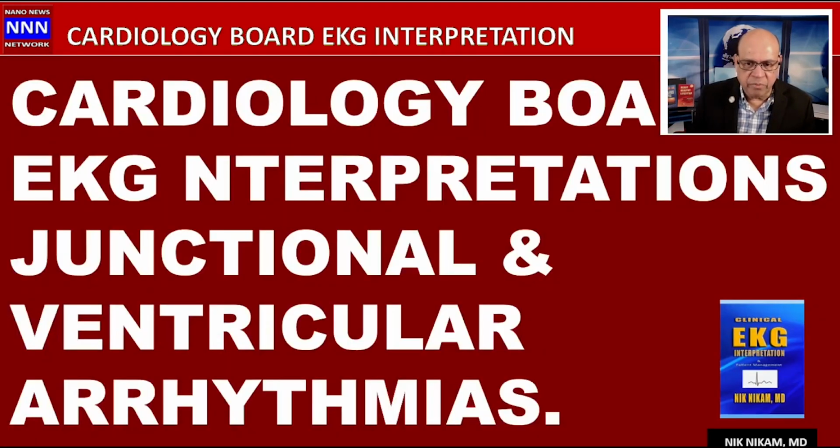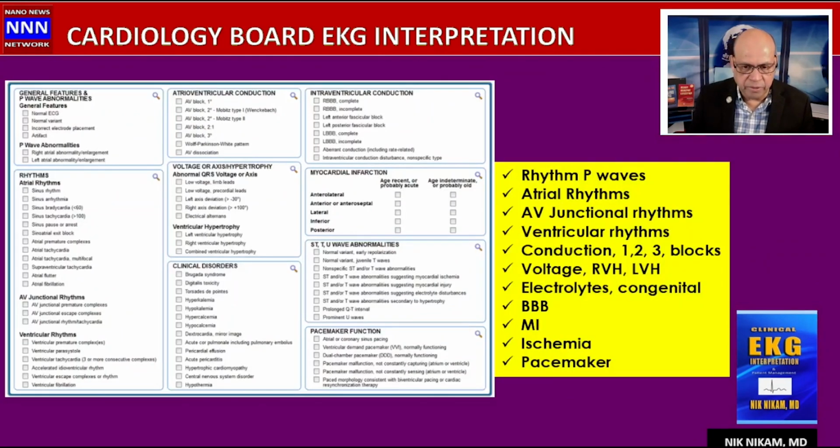So let's proceed with the presentation. The main feature presentation is the cardiology board exam EKG interpretation, junctional and ventricular arrhythmias. So let us see what we can learn from here.